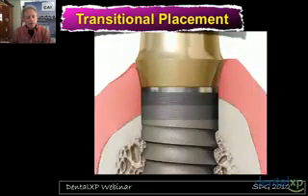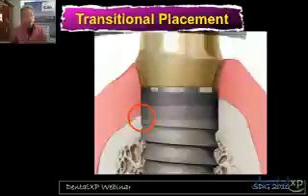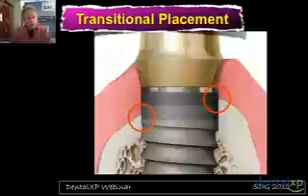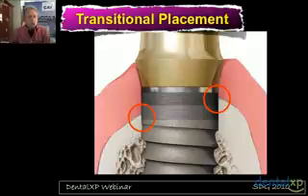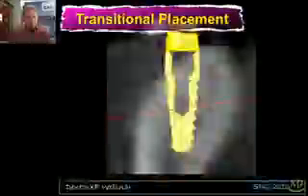That means that part of the implant is actually going to be exposed on the facial, where there's deficiency of bone, or maybe the mesial, or maybe the distal. And so having that capability within the science of the technology of the design of the implant gives us tremendous surgical flexibility in the placement of the implant within a receptor site.